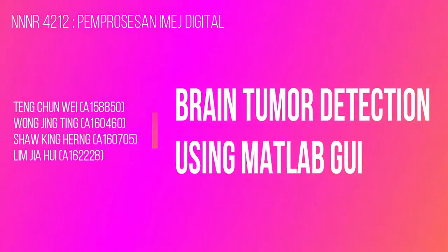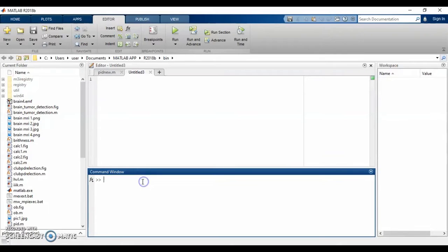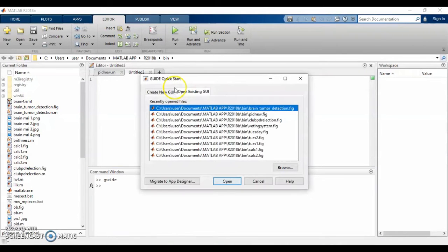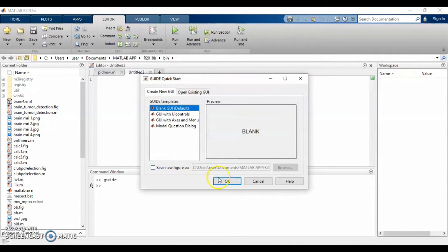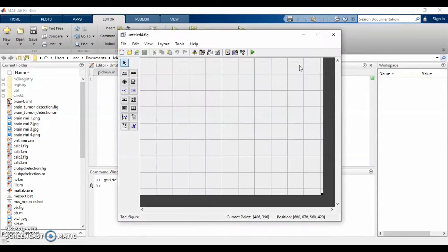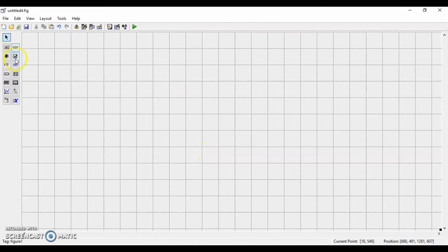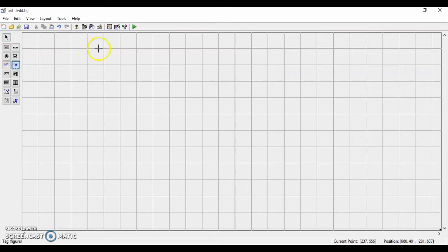In this project, we are going to demonstrate the way to detect brain tumor using MATLAB graphic user interface. So first, we have to load MATLAB GUI. Then open up the space as we needed. And we will use static text to insert our title.